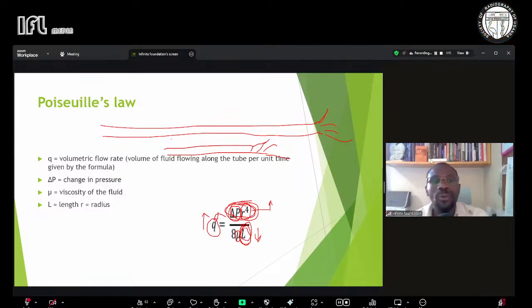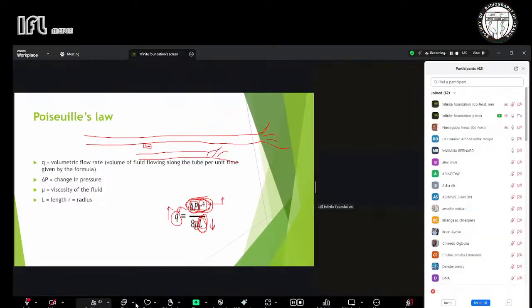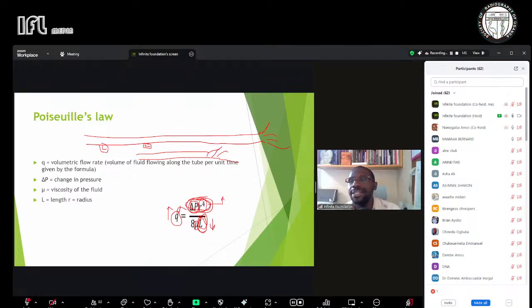So when we increase this distance, it is going to reduce the resistance. If we sample here, we have all this great distance to assess the reflection from the distal bed. And yet if we sample there, the distance is going to be too short.